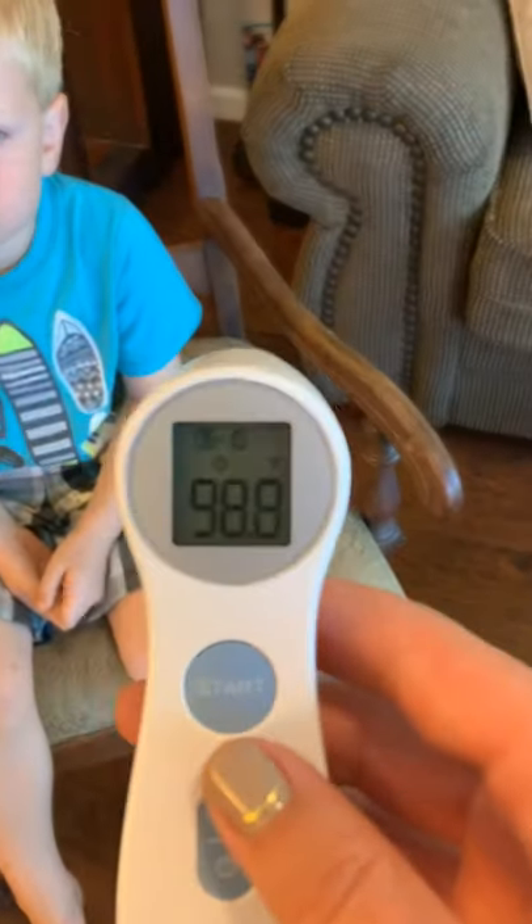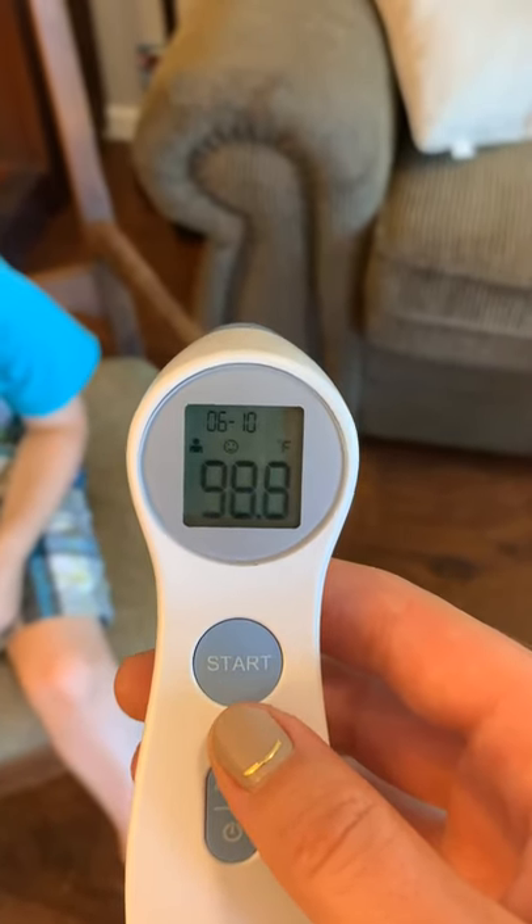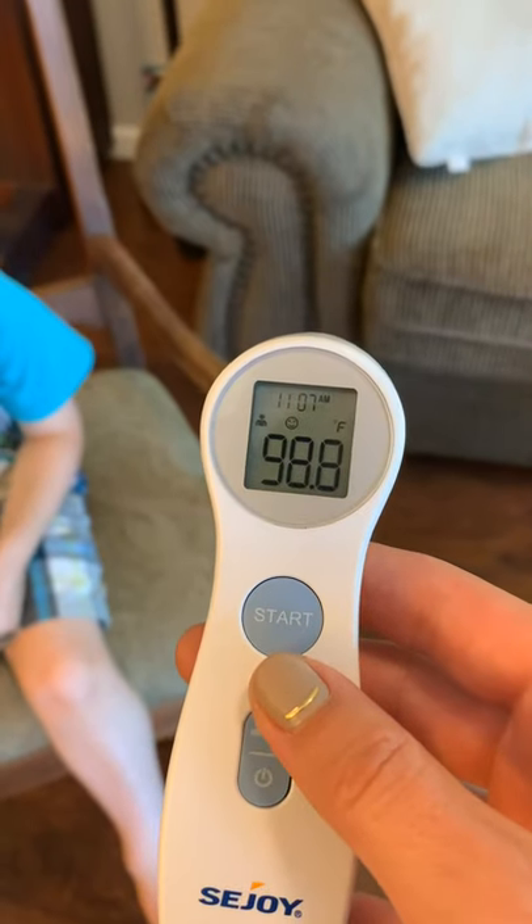Pull the thermometer back and read the temperature value. Be sure to wait at least three seconds before taking another temperature to ensure accuracy.